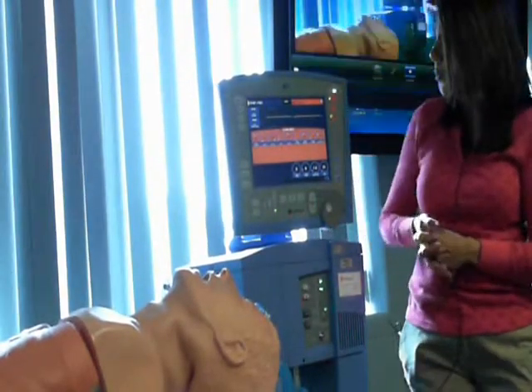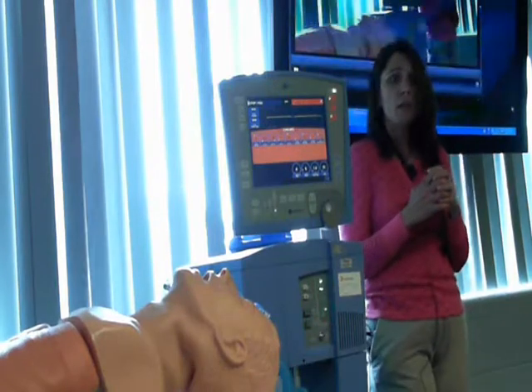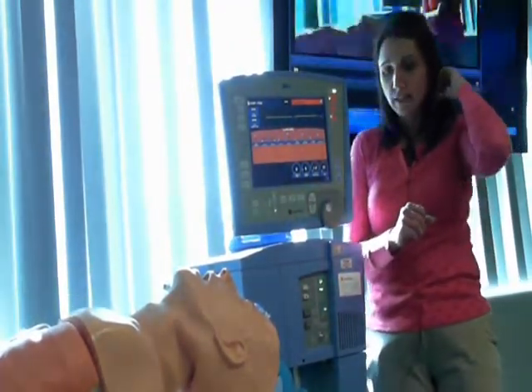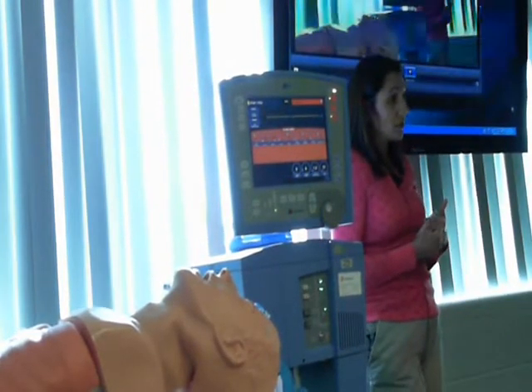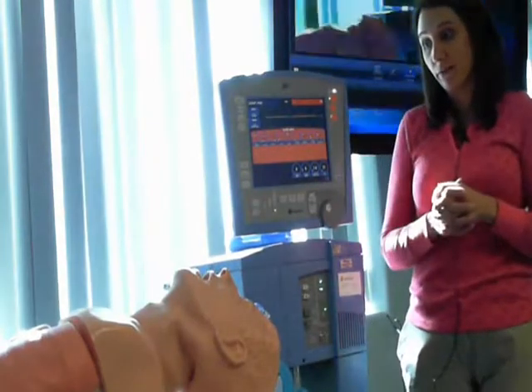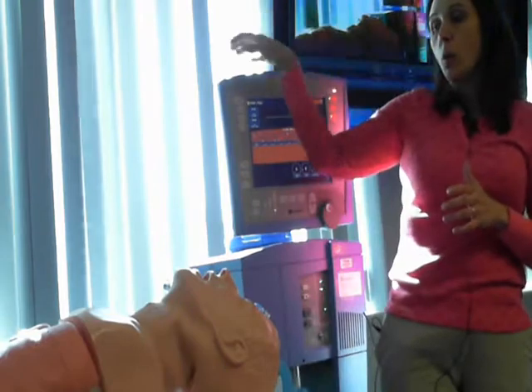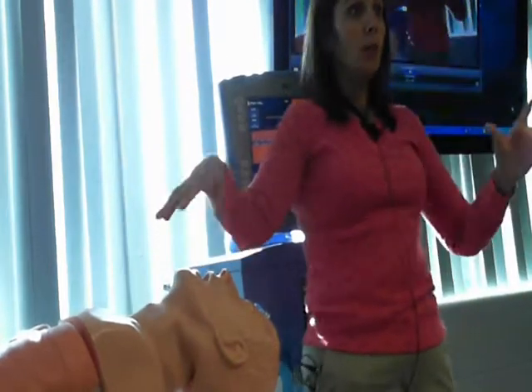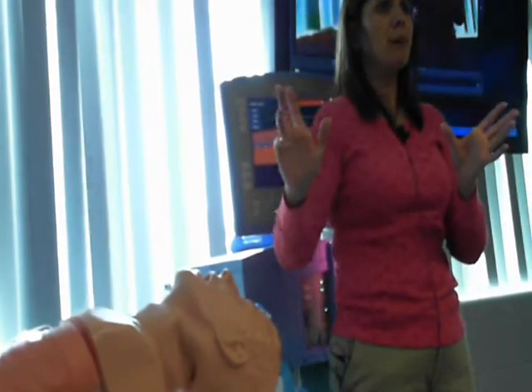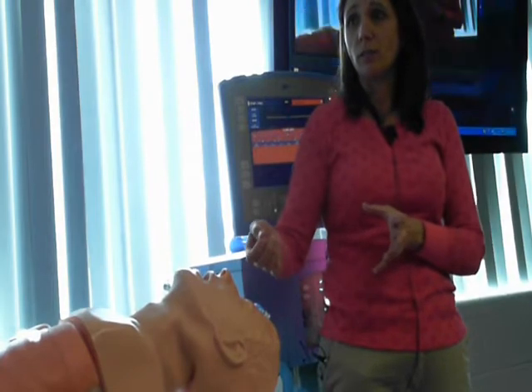Okay. So the next thing I want to go over, we've talked about our modes, okay? We've talked about our FiO2. What I want to get to next is, if you are the bedside nurse on CCUs, there are some things you need to be aware of. First and foremost, what you need to know is when you are moving, one of the biggest things any therapist is going to tell you, please be aware of the endotracheal tube when you move your intubated patient.